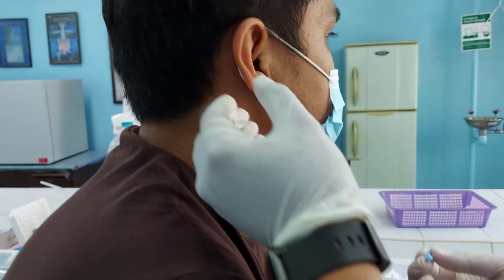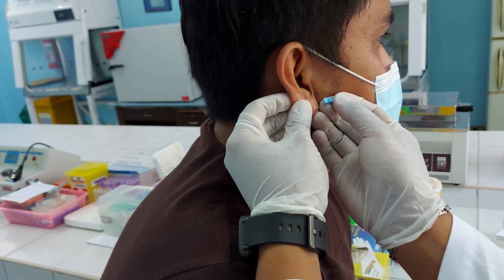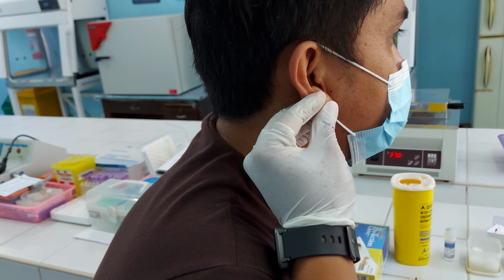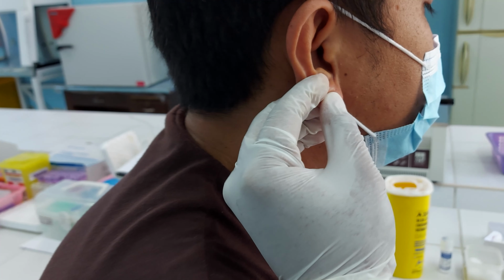Move the filter paper so that each drop of blood touches the clean area. Do not touch the incision directly with the filter paper. And lastly, stop the stopwatch and record the time as soon as the filter paper shows no signs of blood.